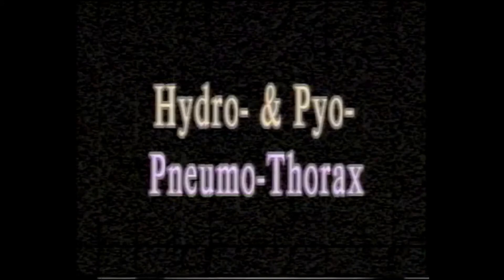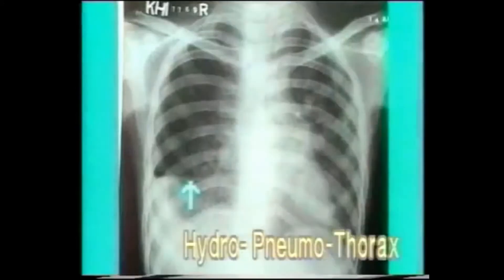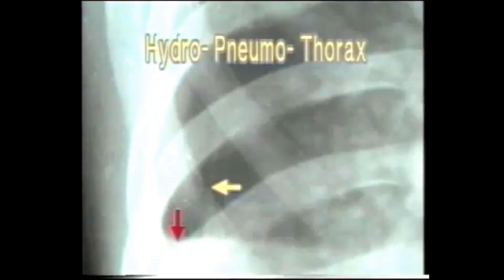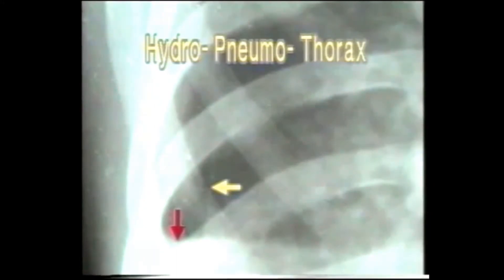When the pleural cavity contains both fluid and air, the condition is termed hydropneumothorax — if the fluid is clear — or pyopneumothorax if the fluid is pus. This X-ray shows a horizontal fluid level in the right hemithorax touching the chest wall laterally. The red arrow shows the horizontal fluid level and the yellow arrow shows the border of the collapsed lung, seen parallel to the chest wall and separated from it by a radiolucent band.